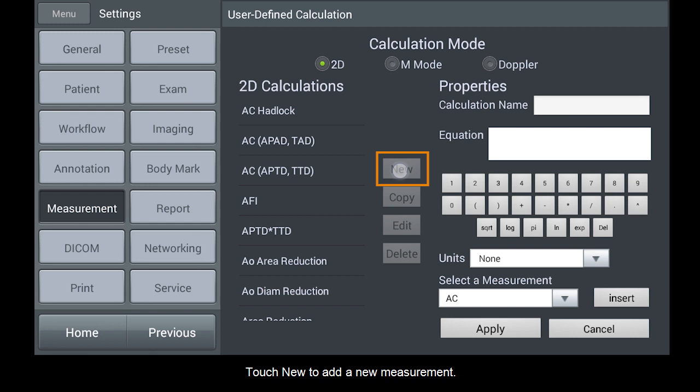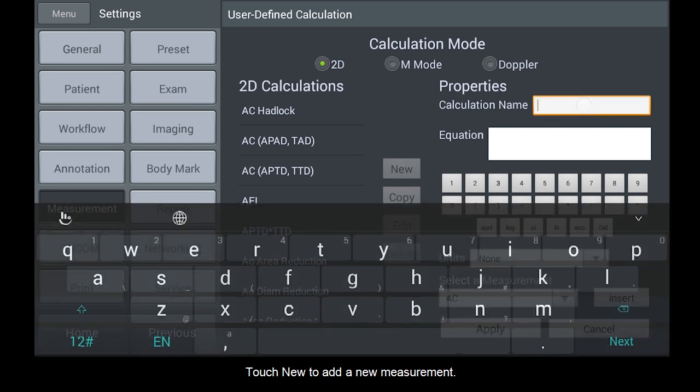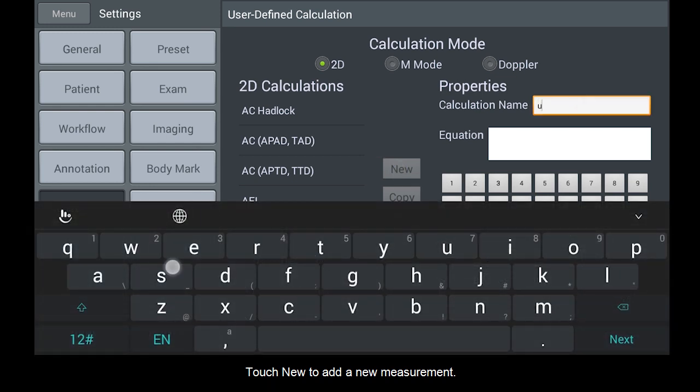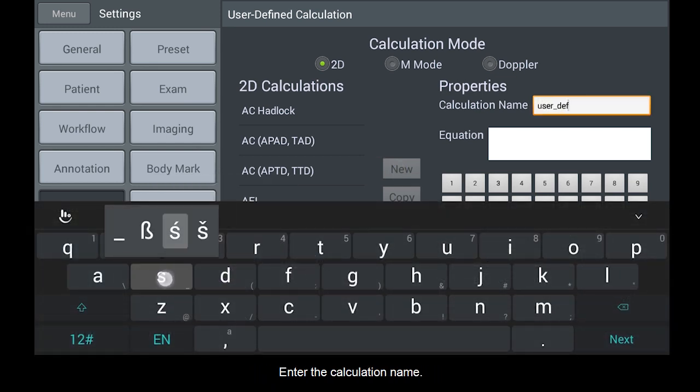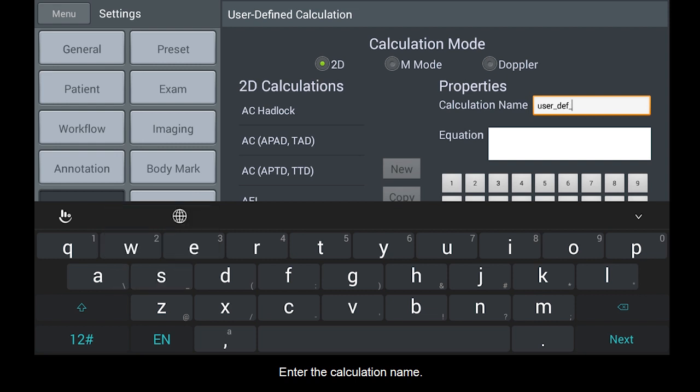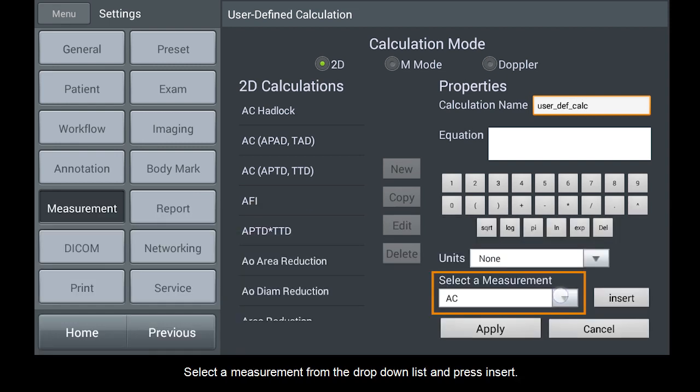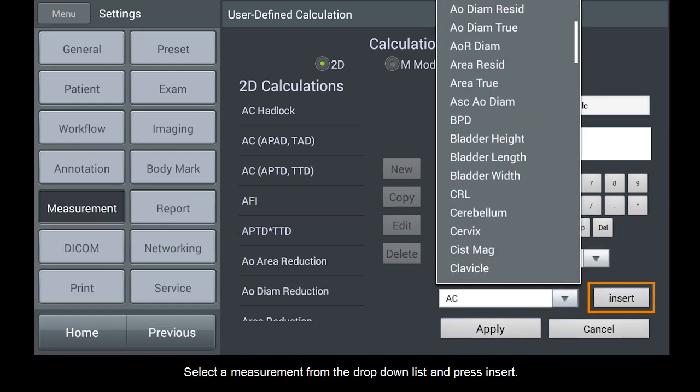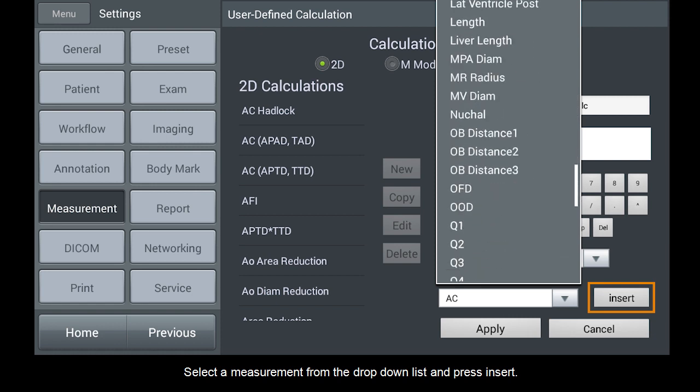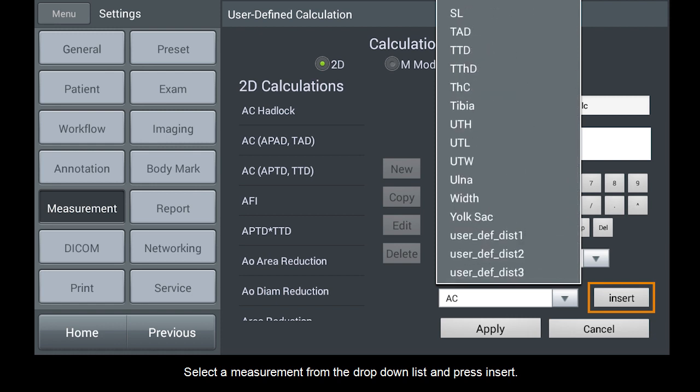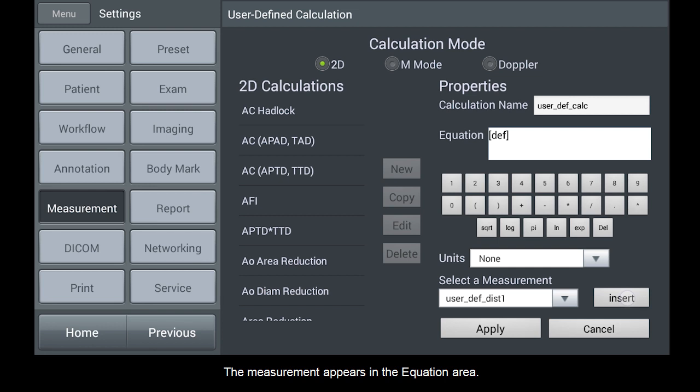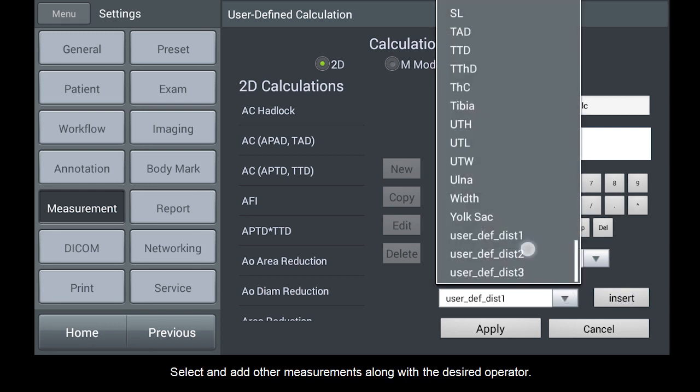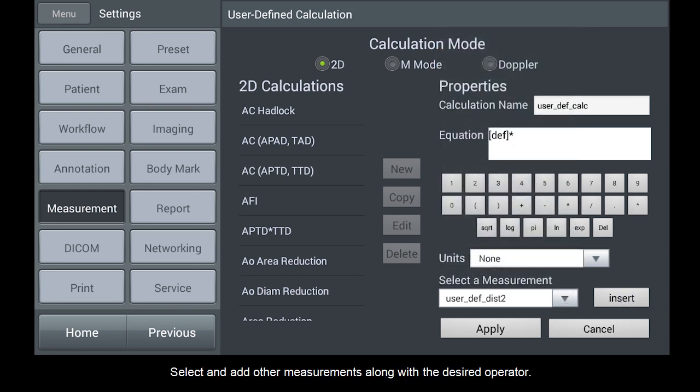Touch New to add a new measurement. Enter the calculation name. Select a measurement from the drop-down list and press Insert. The measurement appears in the Equation area. Select and add other measurements along with the desired operator.